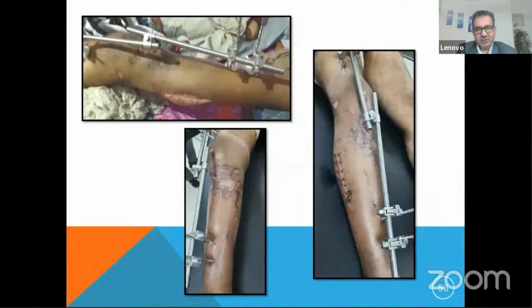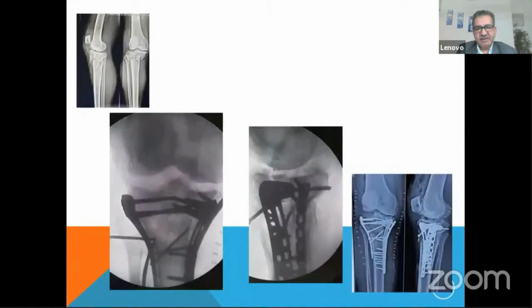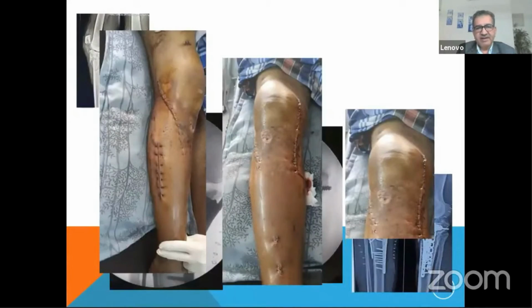a very bad injury, so a prophylactic lateral fasciotomy was done, and you can see there's an anterior wound. So what we planned is after a few days we could close the wound. While you go for the second operation, there's no serious discharge, and give some time. And since there's the anterior wound, we decided not to go for an anterior midline approach, and we fixed this fracture, and then we had gone for the anterolateral and the posteromedial approach. And you can see that even that wound, which was there over the tibial tuberosity, has healed very well.